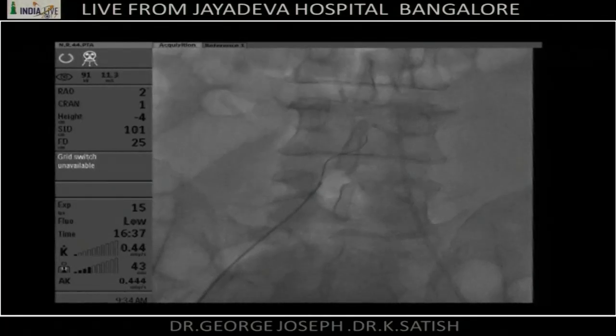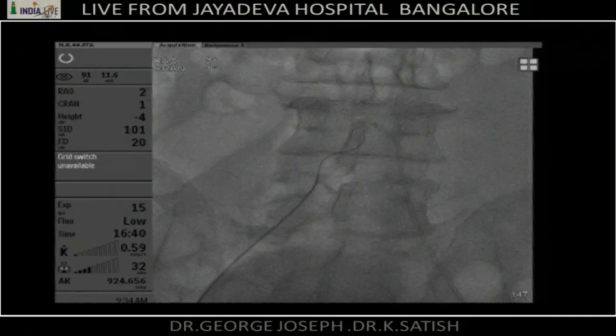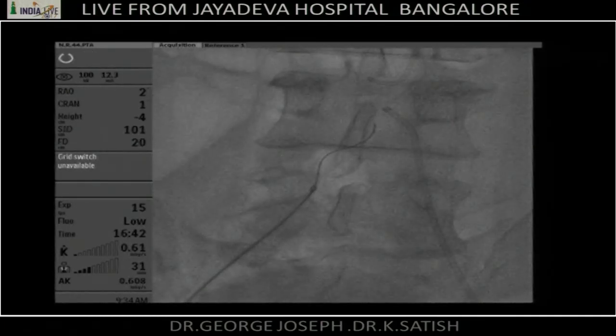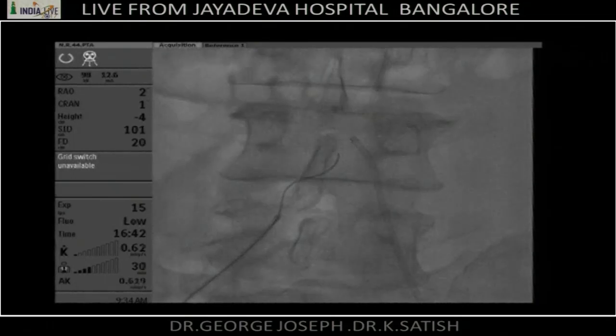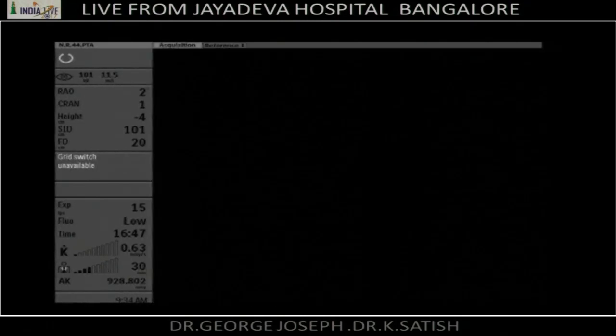Can we get one mag on that, please? Right, so we can do a test there to see how things look. You have contrast? Okay. Right, so we're going to test. You have contrast? Yeah, we have, sir. Just test. Don't aspirate. Ready? Yeah, one second.